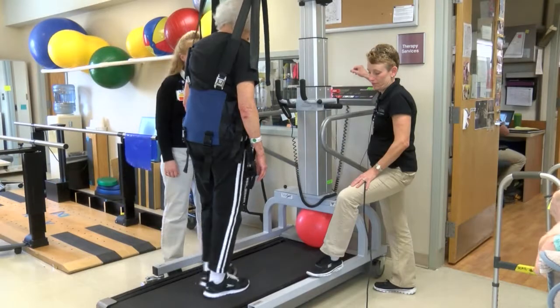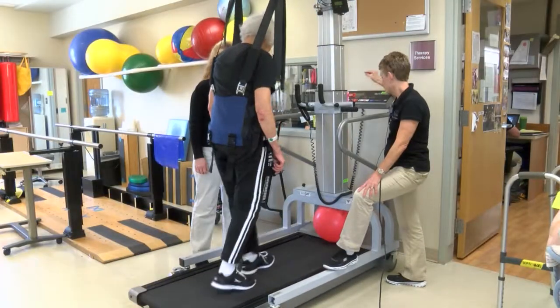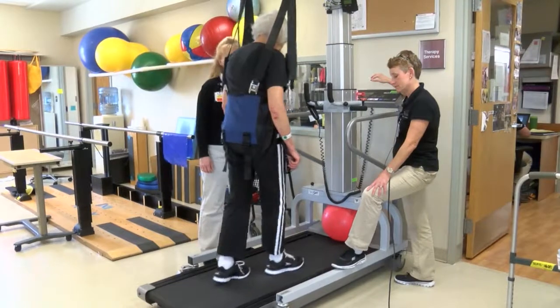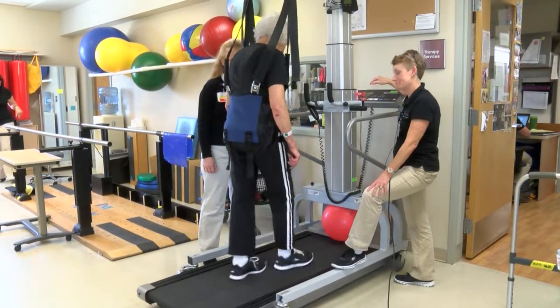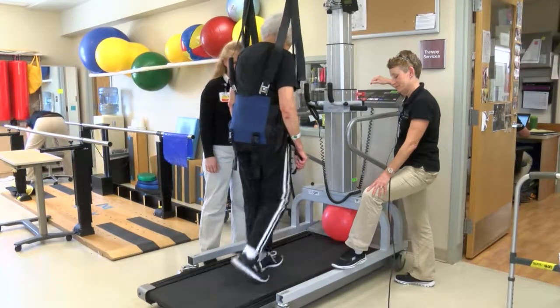Because she's on the treadmill she can get nice even step lengths and she doesn't have to worry about falling. As we progress her through the gait training we can have her gradually release one hand and then hopefully release both hands so that she can work on getting a more normal trunk rotation and arm swing.